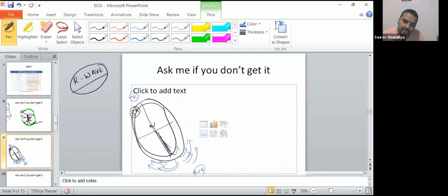How do we record it? So from here, you see the direction which was coming like this now started moving like this. Got the point? So what is happening here? A strong action potential is going to set in because it is a ventricle. Now I think you remember leads like V1 and V2. If you see that lead, the R wave is completely down, but the magnitude and amplitude are the same. So it all depends upon how you read it, how you record it. We will come to that part later. First, try to understand why. And here, don't ask questions about the leads because you will get confused.